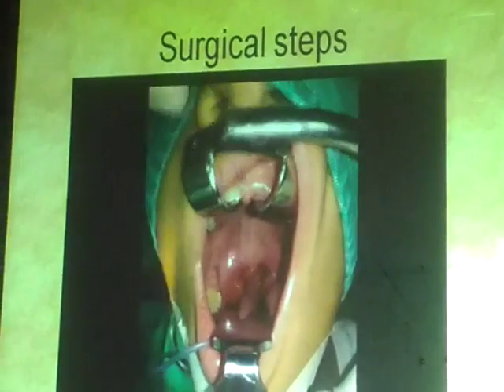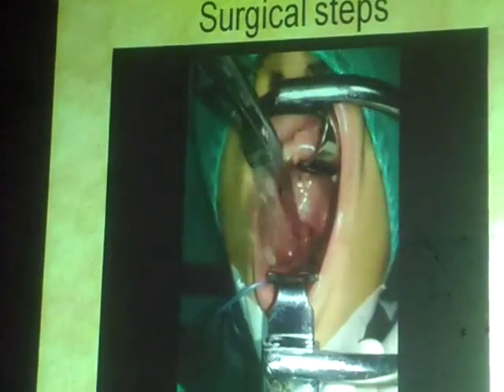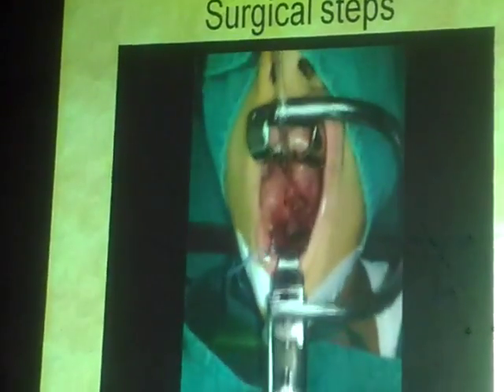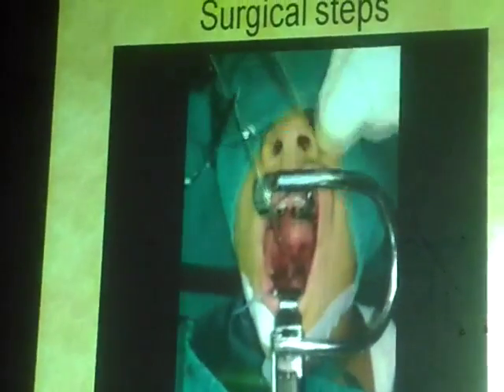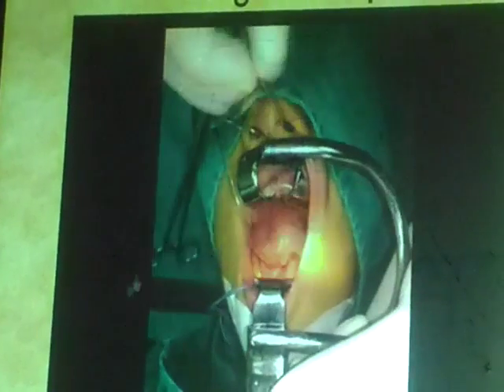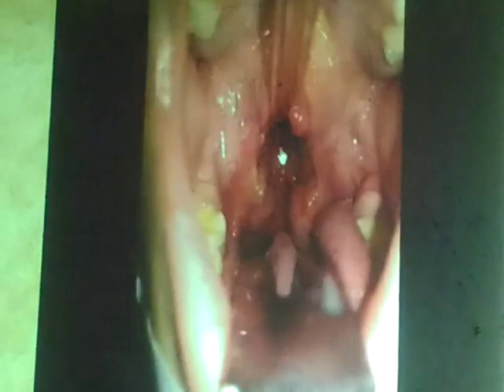First, the patient is lying flat, nothing under his shoulders, with the mouth gag with a slot, taking the endotracheal tube upwards with the tongue. Then I will put a catheter through each side of the nostrils, and then I will hold them back so that I can pull the soft palate upwards, so that I can have an unobstructed view towards the nasopharynx.